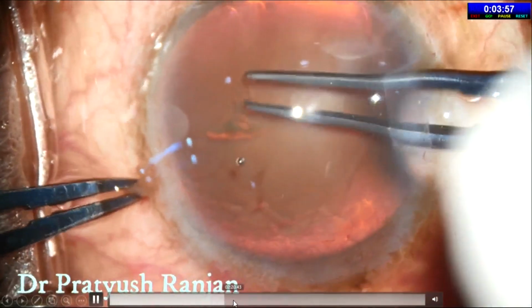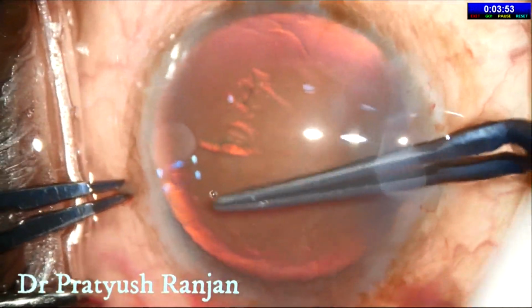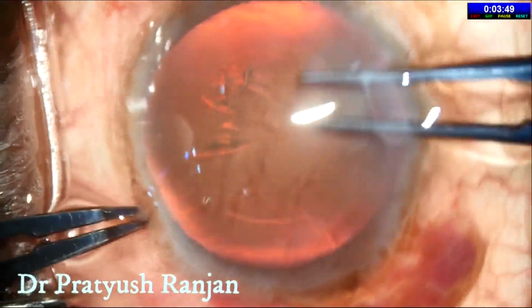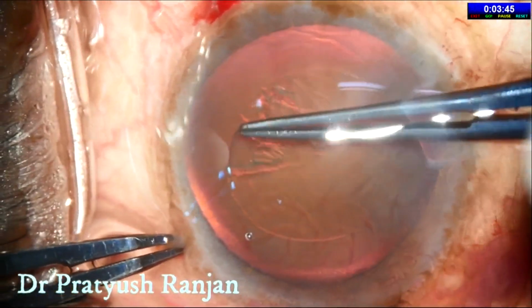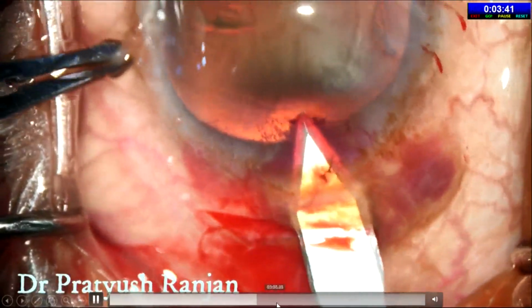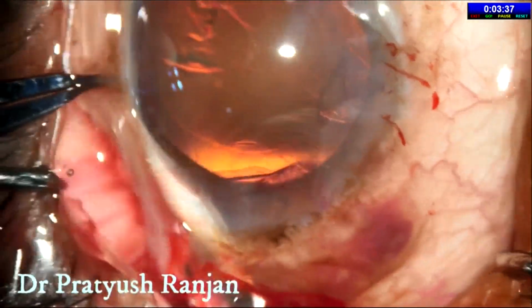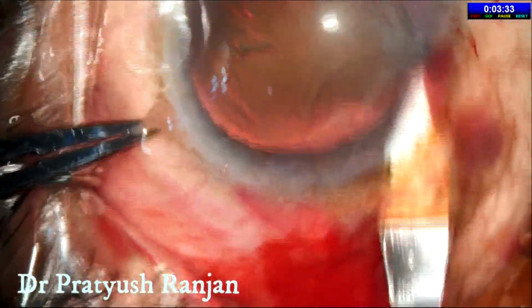Now I do 90-degree to the capsular axis using Utrata. It gives me better control, better hold. Then entry. This is the most important part. It should be in a straight line on Descemet's.